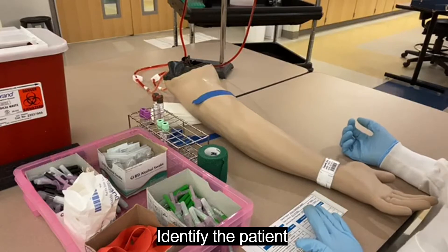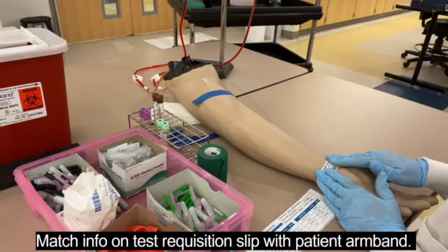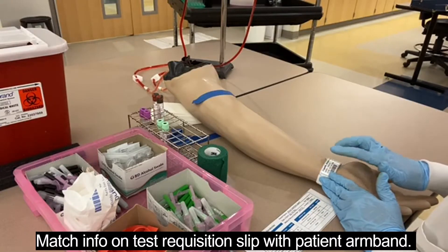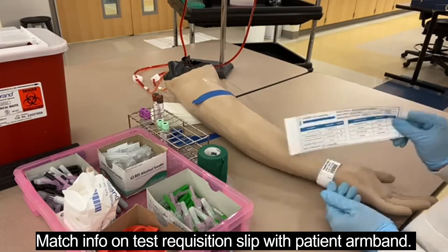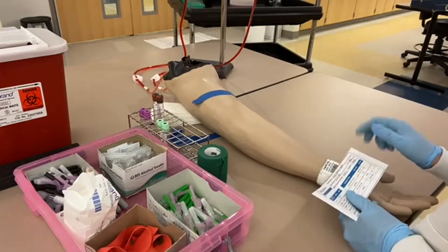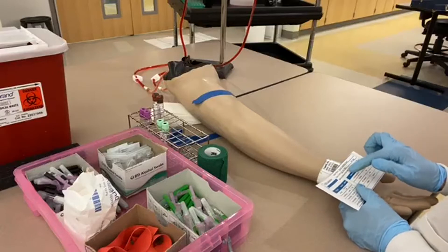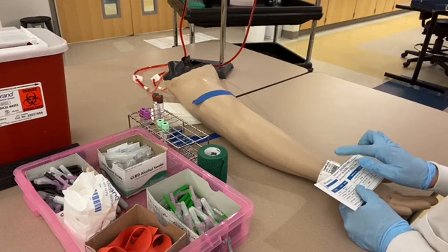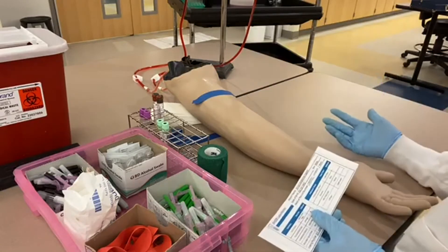For this patient, we'll say he doesn't have mental capacity, so I have an armband for him. I'm going to double check my requisition slip against his armband to make sure the name matches: Arturo Valentine Capetti. His date of birth matches — 2/14/1962 — and his MRN matches — 1965721. We have a positive match, so as far as we can tell this is the right patient.